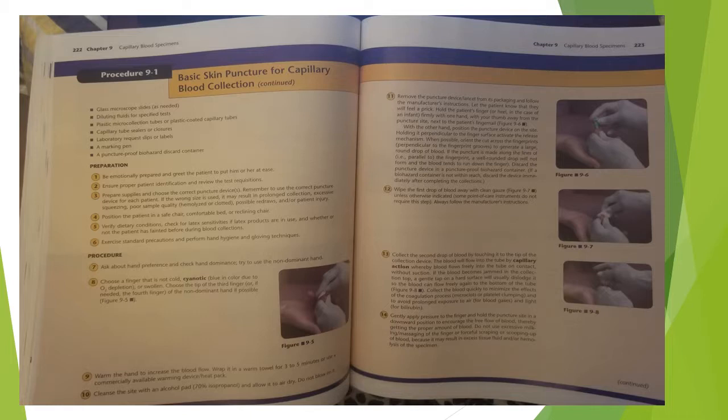Wrap it in a warm towel for 3 to 5 minutes or use a commercially available warming device or heat pad. Cleanse the site with an alcohol pad and allow it to air dry. Do not blow on it. Remove the puncture device or lancet from its packaging and follow the manufacturer's instructions. Let the patient know that they will feel a prick.